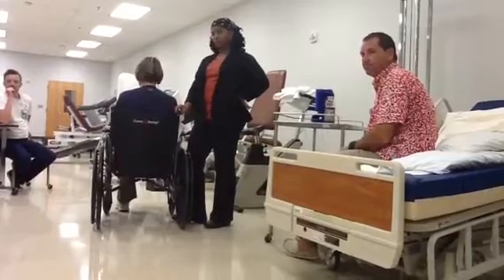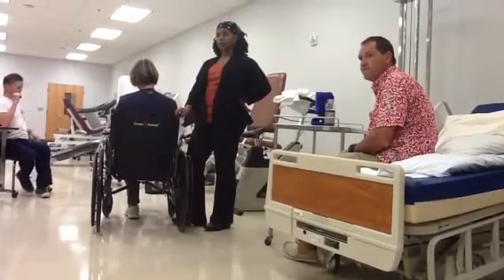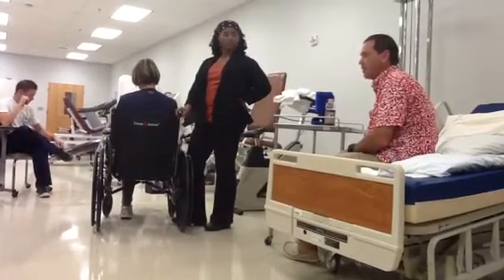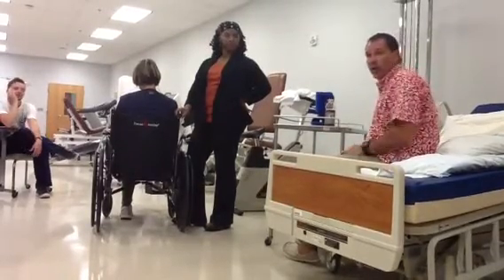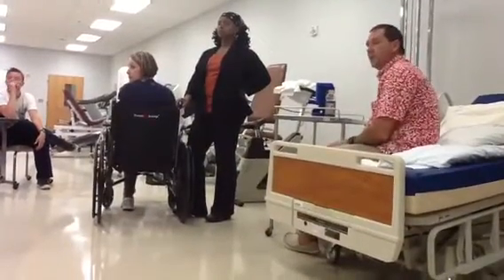But I was thinking more of the height of the back, so that they have the correct 90. Yeah, the 90-90. The height of the back is probably going to be the least of my worries. Unless it's just up to her neck. Right, or what if it were like that chair back there, but just sitting right?